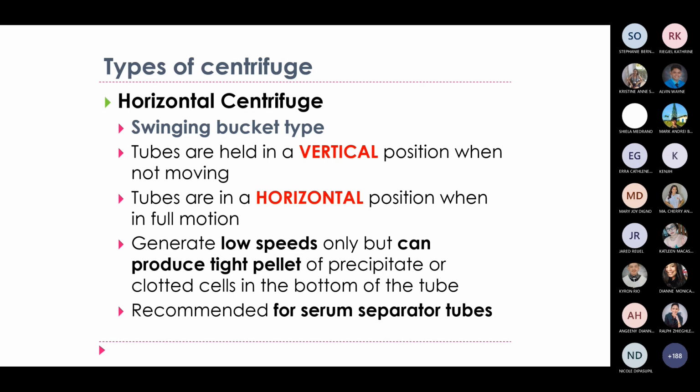Or what part or test in chemistry in general? The one where you cannot use gel, because it gets absorbed. Therefore, it will cause a falsely decreased or falsely low value. Where is that? It's in TDM. What is TDM, everyone? Anyone? Therapeutic drug monitoring. So you cannot use tubes with gel separator.